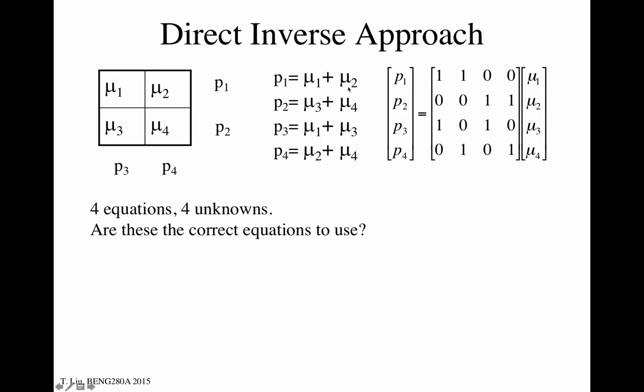So that's the integration along that line. In this case, it's a very low number of pixels, just 4 total pixels, so 2 this way. And then across here, the integration gives me mu3 plus mu4. I don't know what they are yet, but I do know this value and this value, right?